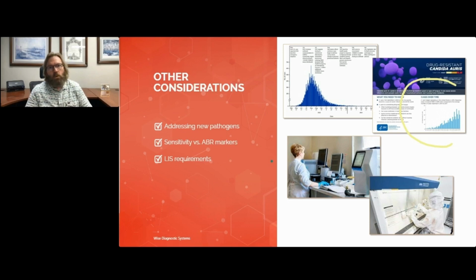And so as we were looking to grow our wound business, we took a look at this and said, hey, we were doing more wound specimens. It might make sense, the next time we go to place an order, to update our panel to include the Candida auris, especially because of, again, the markets that we serve.